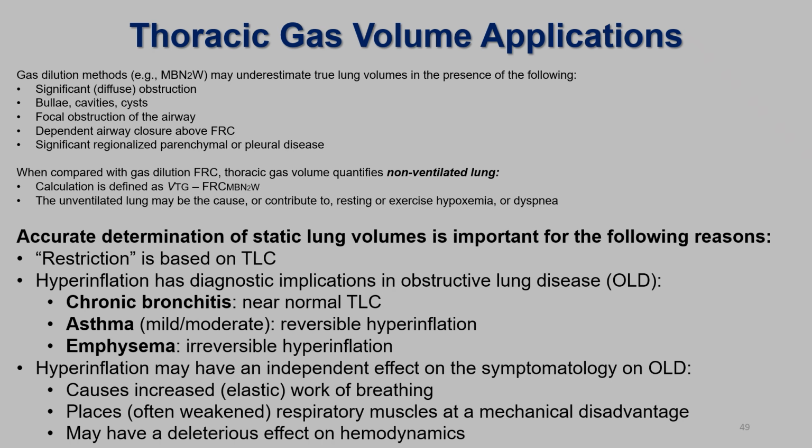Accurate determination of static lung volumes is important for the following reasons. First of all, restriction is based upon TLC. Secondly, hyperinflation has diagnostic implications in obstructive lung diseases. And thirdly, hyperinflation may have an independent effect on the symptomatology in obstructive lung disease.